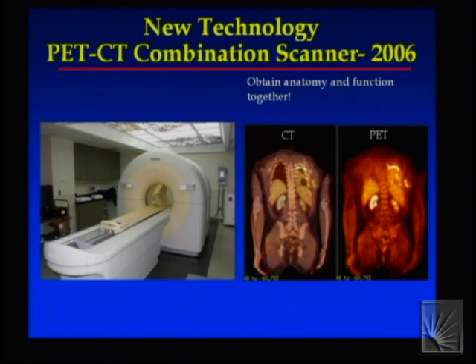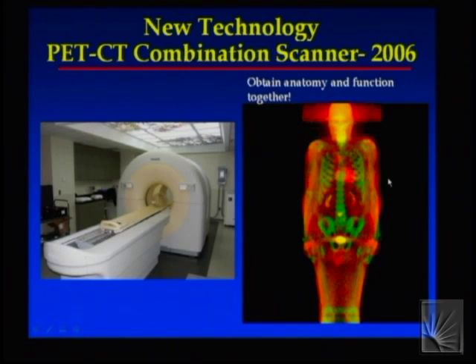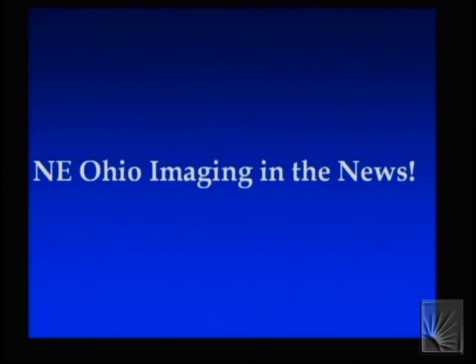But by combining the PET scanner and the CT scanner together in one instrument, we get the best of both worlds. That is, the high-resolution CT scan and the metabolic information from the PET scan. That again, using some techniques from our computer science friends, merge those things together to get the best of both worlds. That is, high-resolution CT scan with the lower-resolution metabolic information together.